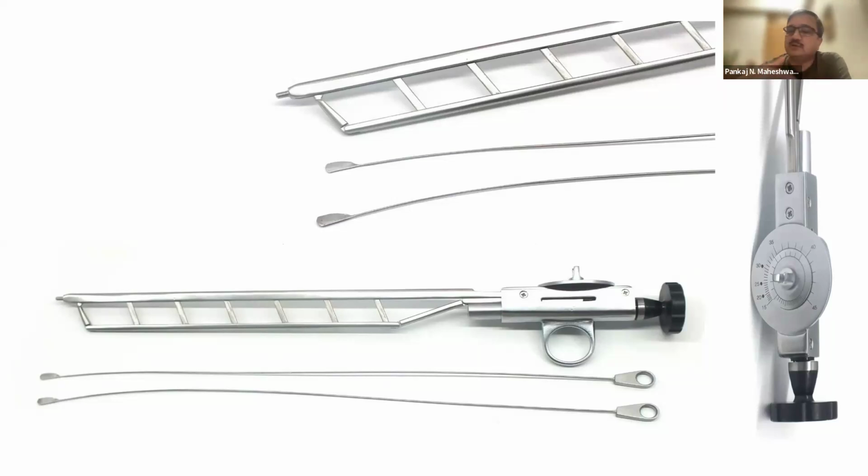As in your description, you said the knife goes inside. If you press on the knife with your thumb, the knife dips inside. Only when there is a tough tissue, then it would cut. If it's a soft tissue, it would not cut that. So it does not cut the mucosa, it only cuts open the fibrotic rings.